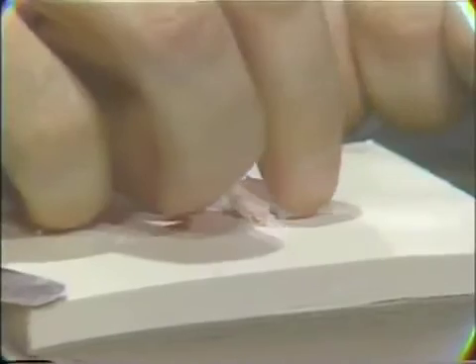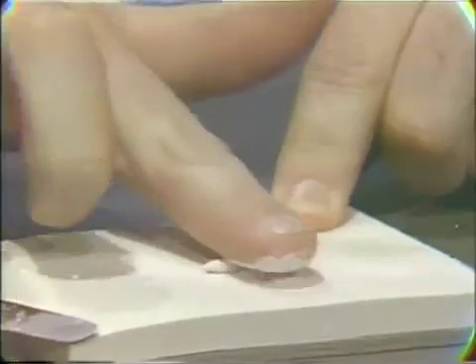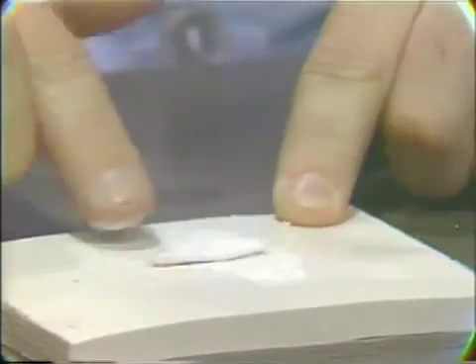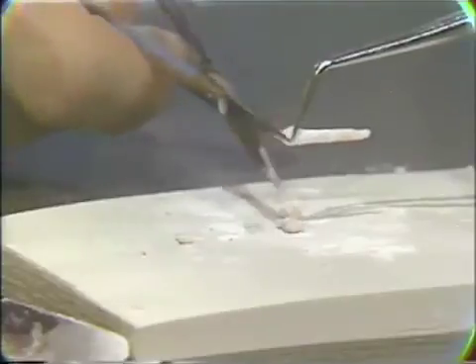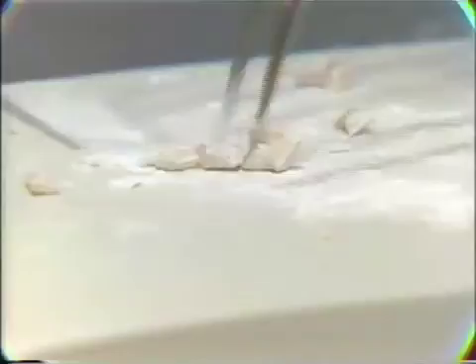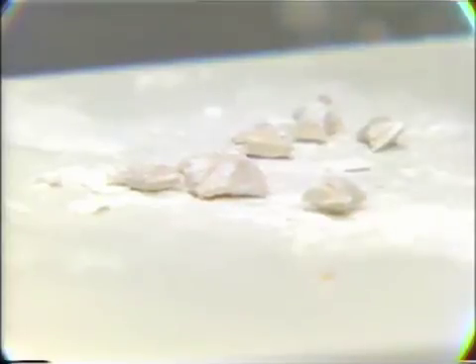This material can then be picked up with the fingers, brought over and rolled out on the excess powder that's there. In order to facilitate placement of this material into the prepared cavity, we can use scissors to cut it into small increments. These smaller increments are now ready for insertion into the prepared cavity.